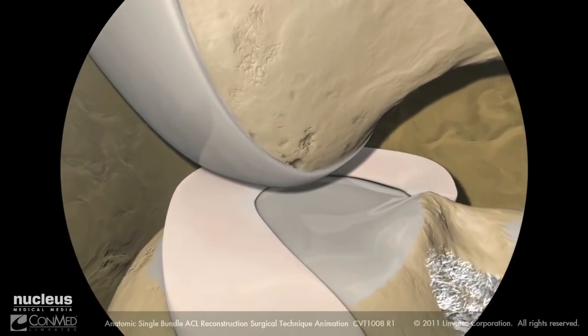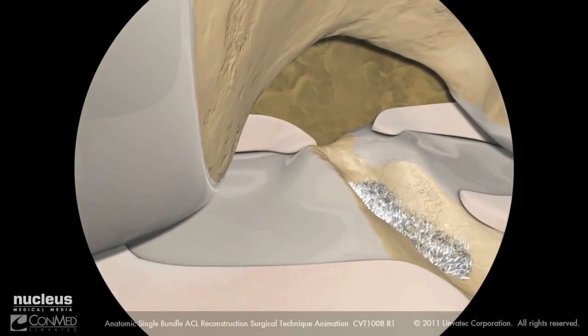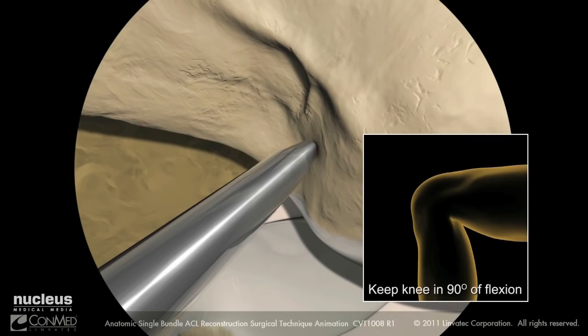Using an 11 blade, incise the skin, making sure to orient the blade away from the femoral condyle to prevent damaging the articular surface. Switch the arthroscope to the anteromedial portal. Mark the center of the femoral ACL footprint using a microfracture awl.